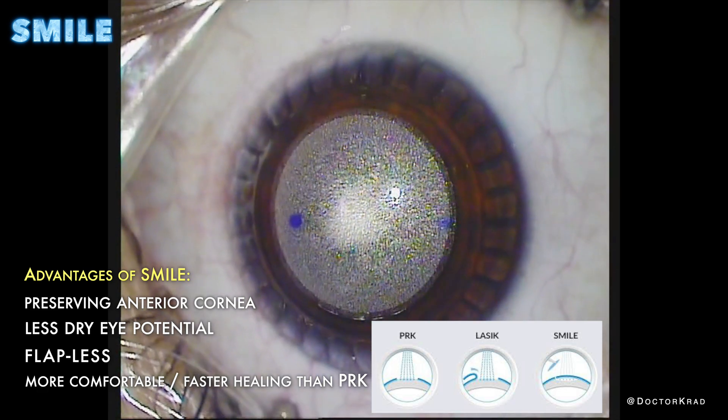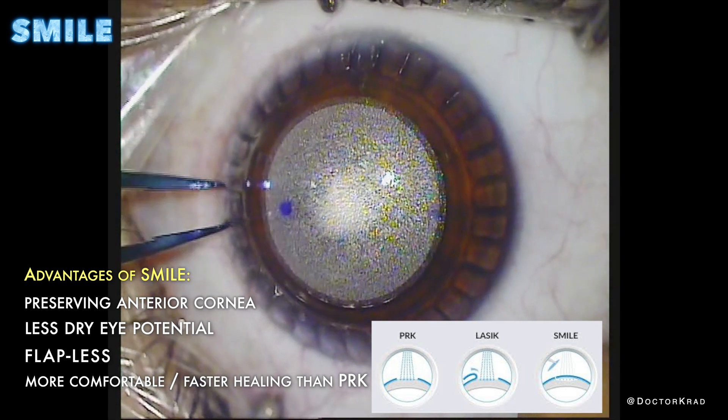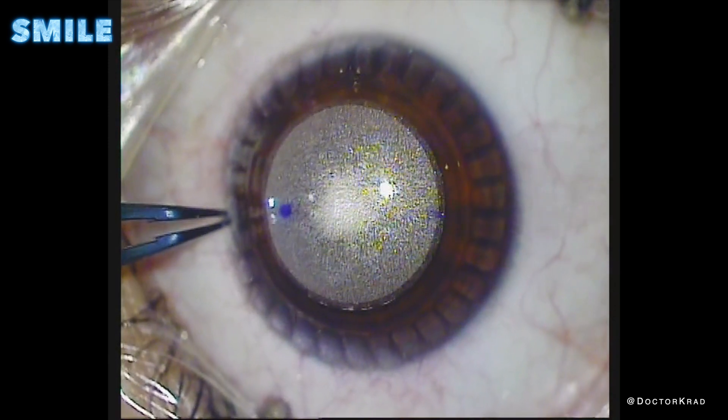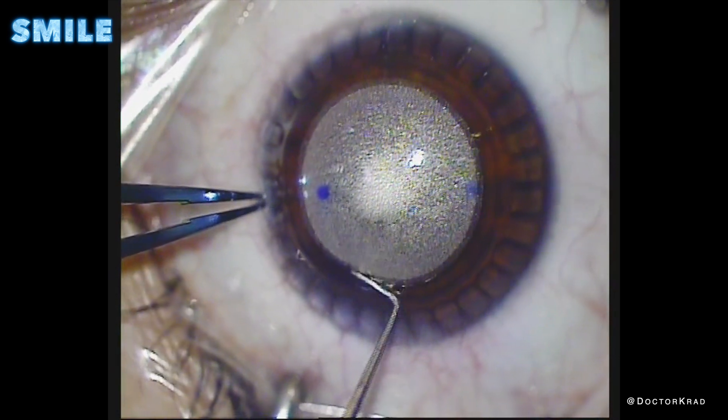It's a really clever procedure for those who are good candidates and want to get rid of their glasses or contact lenses. So here we are going to open the incision that gives us access to the disc of tissue we created. The patient's eye is numb, and they don't feel any of this.